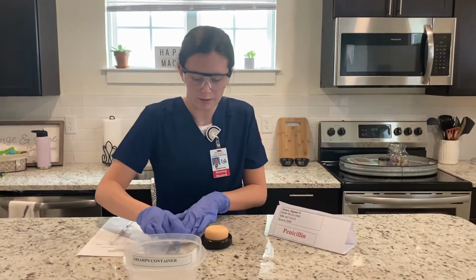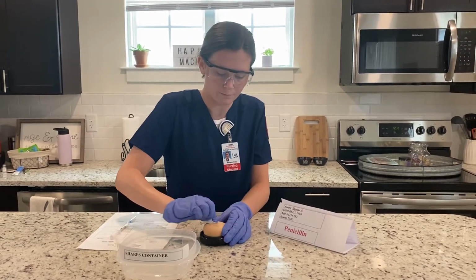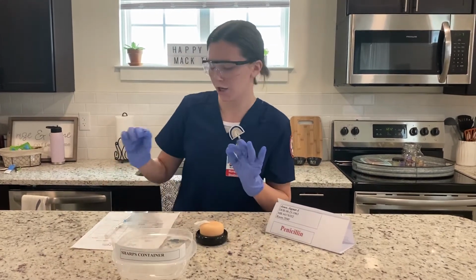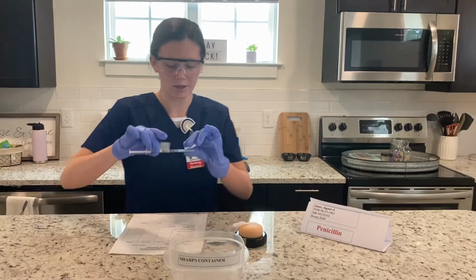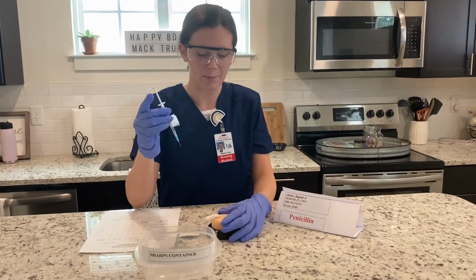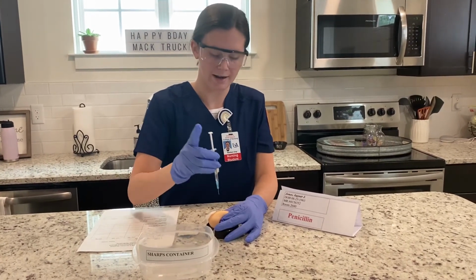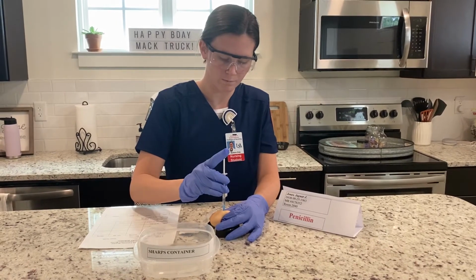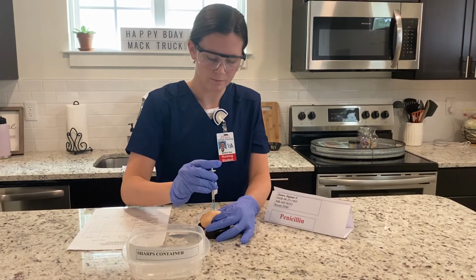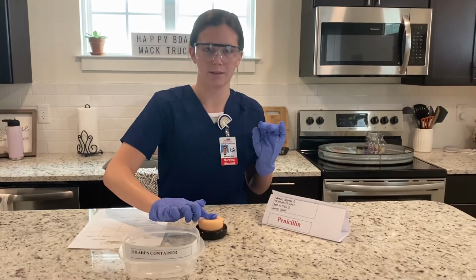So I'm going to clean the site in a circular motion with the alcohol pad. And I'm going to leave that pointing at the site where I just cleaned and let it dry. And then I'm going to get my syringe and uncap it and dispose of the cap into the sharps container. And then since I'm able to pull up 2 inches of the skin, I'm going to go in at a 90-degree angle and inject the medication. Take out, dispose, release, apply gentle pressure, being careful not to massage.